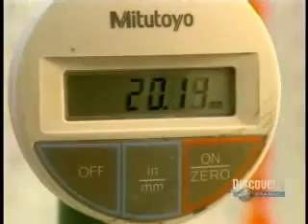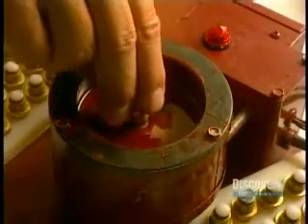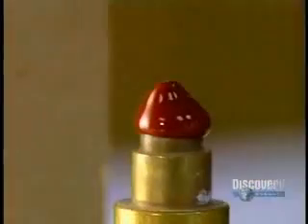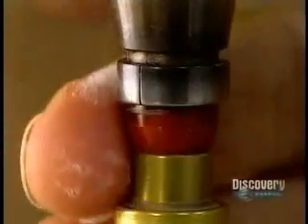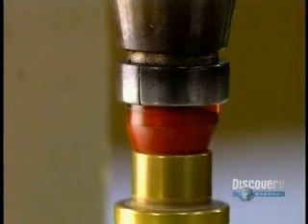A technician measures lens thickness with an extremely precise gauge. They now shape the outer surface, the part that touches the eyelid. The lens is glued with a special warm wax. When the lens is completed, an ultrasound device will remove the wax. The wax takes on the desired shape in just seconds.